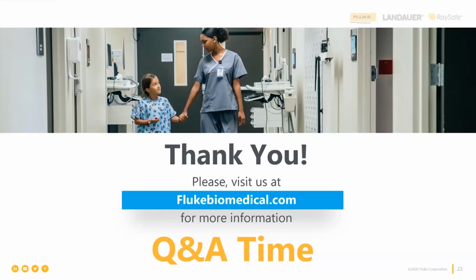Yep. Next question. This question is also sort of related to what we were just talking about, so I kind of want to cover it all at the same time. Does testing, so additional discharges, affect the lifetime of the AED capacitors? And if so, how can we estimate its degradation? No, it's not going to degrade the capacitors. What it's going to do is use up the battery.